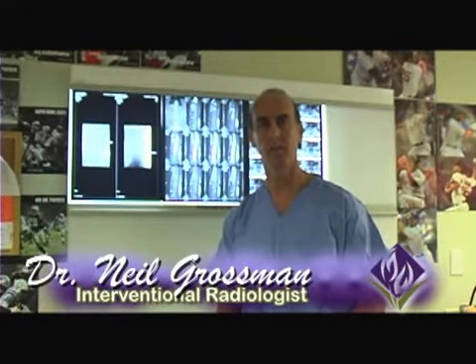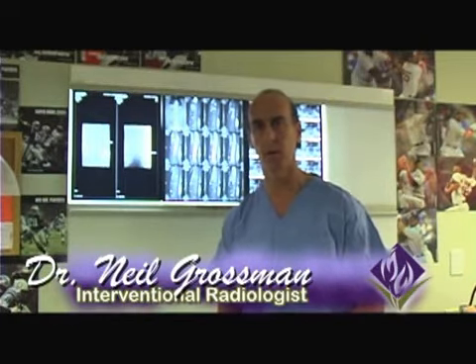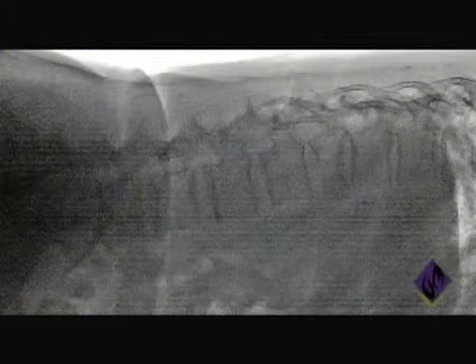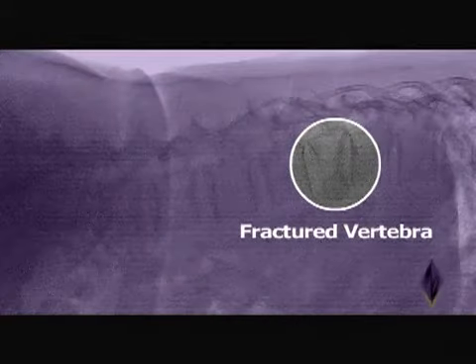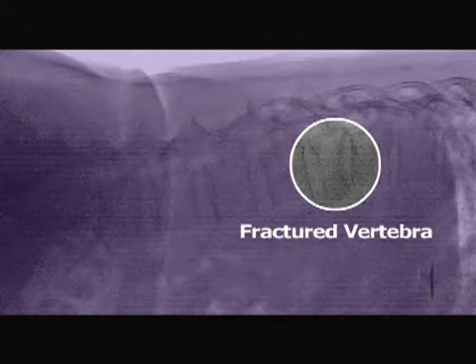Today's case is a 68-year-old female who presented to the emergency room with severe back pain following a fall. Initially in this patient, plain films were obtained, and I evaluated the patient. The patient's back was percussed, eliciting an area of maximal discomfort, and this level was marked. And you can see that this is a lateral view of the lumbar spine.